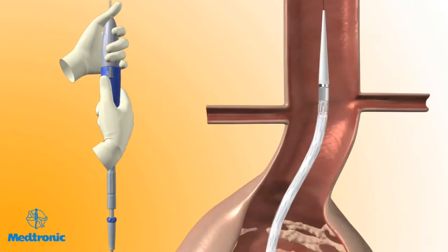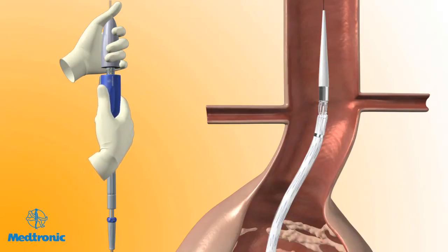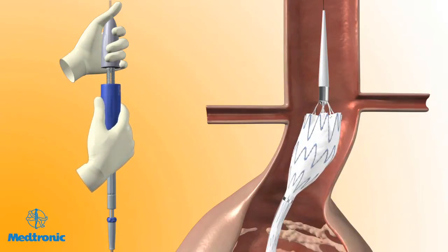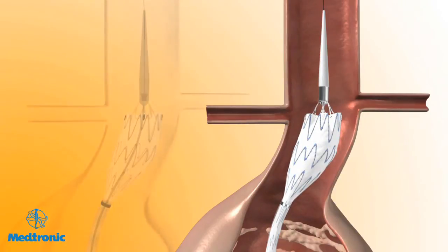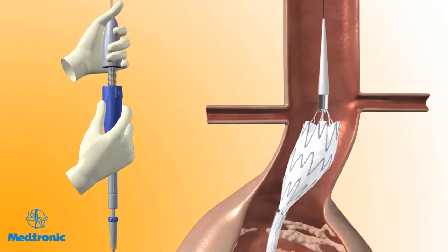With one hand on the front grip, hold the Endurant aortic delivery system stationary. Next, slowly withdraw the graft cover with the other hand by rotating the slider counterclockwise in the direction of the arrow until 2 to 3 of the covered stents have been deployed. Use angiography to verify the position of the stent graft in relation to the renal arteries. If needed, gently move the entire delivery system proximally or distally until the proximal end of the graft material is even with the distal edge of the lowest renal artery.